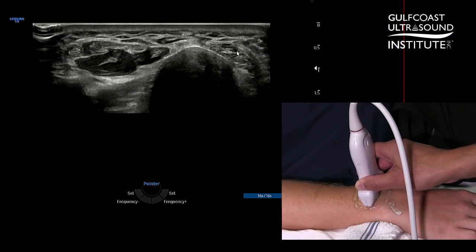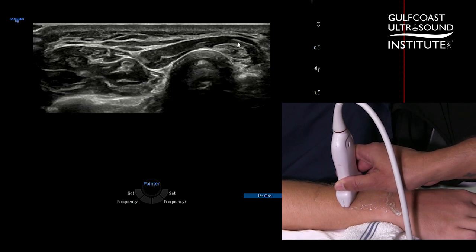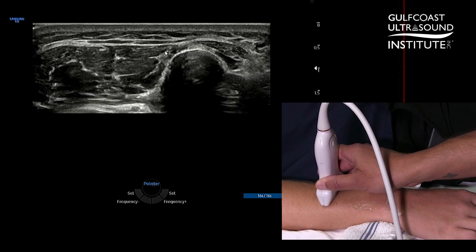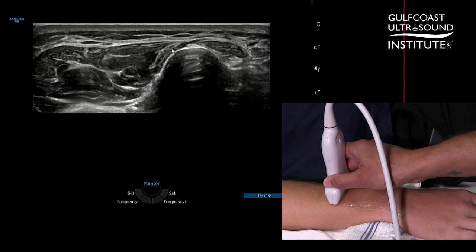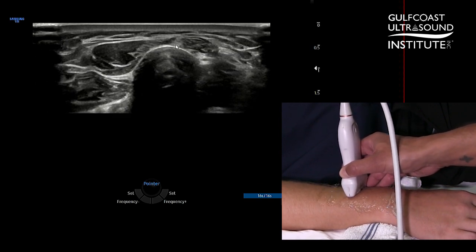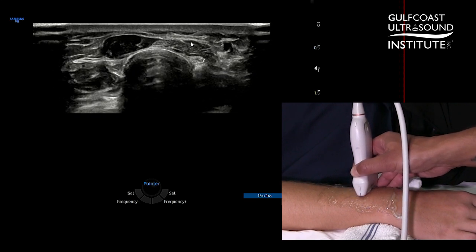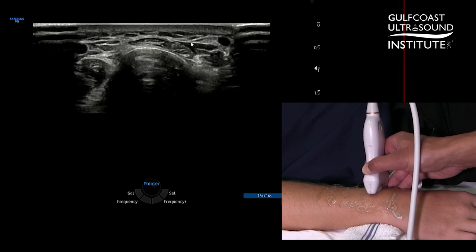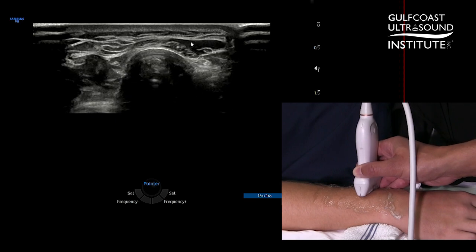As I scan proximally, we see two tendons and their muscles crossing over the top of compartment two. This is compartment one, containing the abductor pollicis longus tendon and the extensor pollicis brevis tendon. These cross over the top of compartment two, and this being the more proximal intersection — where I'm looking for fluid between the tendon sheaths or inside the tendon sheaths, indicative of tenosynovitis. This would be positive for proximal intersection syndrome, the more common of the two, also simply known as intersection syndrome.